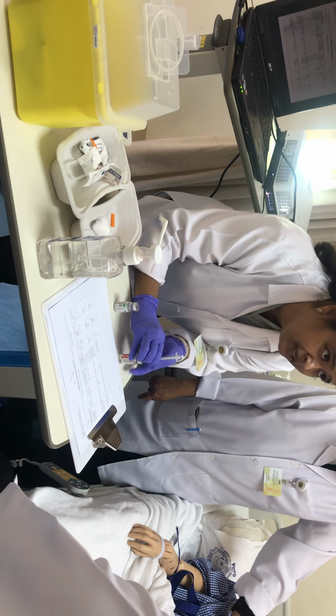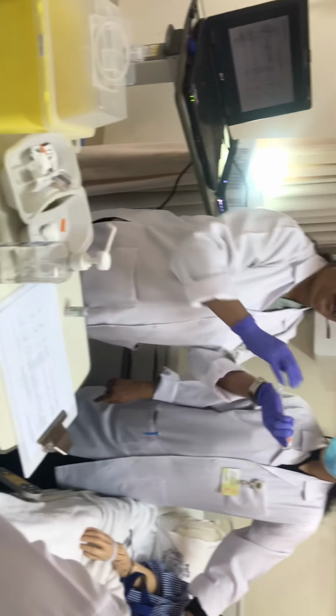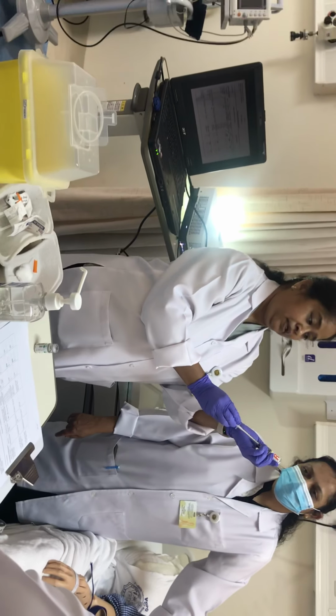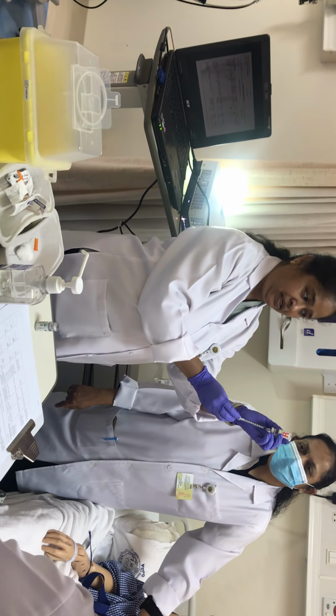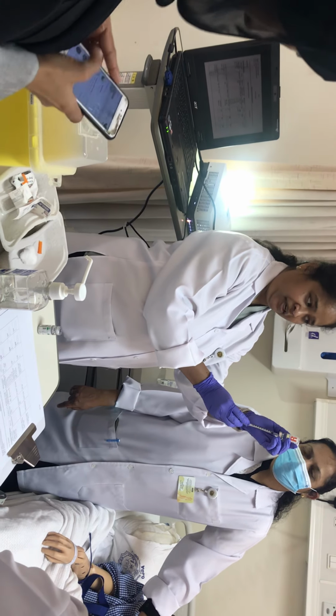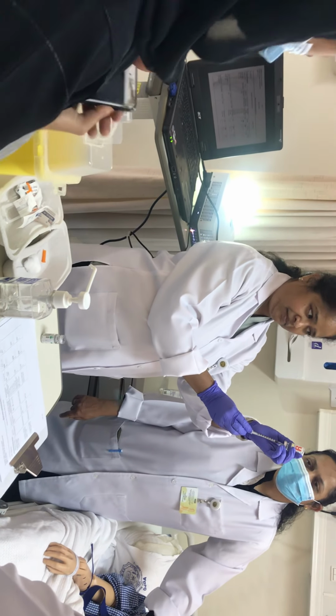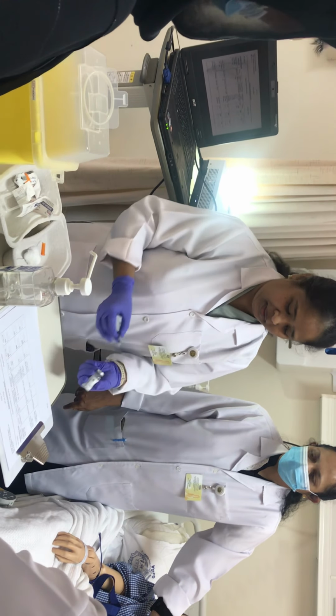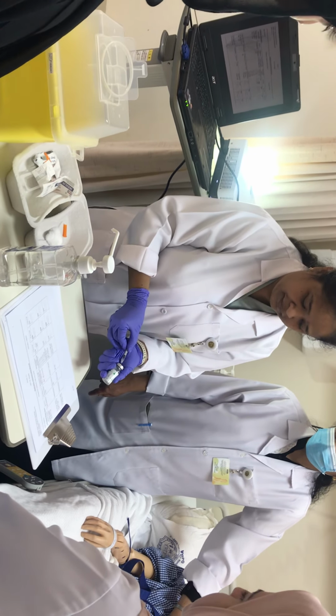Push it. Immediately I'm just taking it. You understand why I pushed air there first? So that once I finish, I'm withdrawing 10 from here. As I said, if there is a problem, if you have taken extra, you can push it back here, but not in the other one. Finished? Now be very careful.